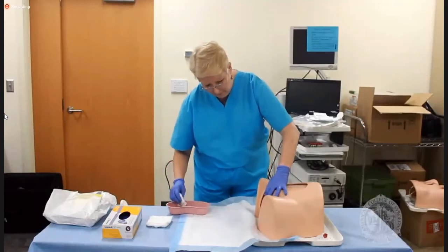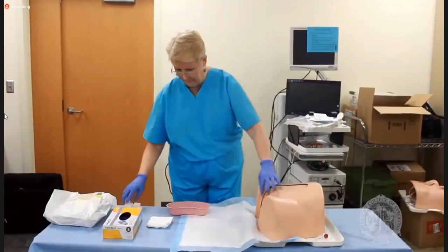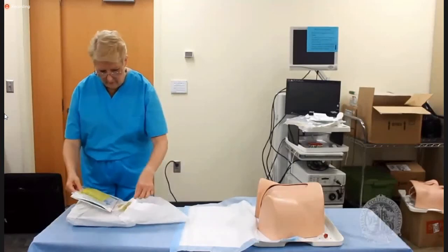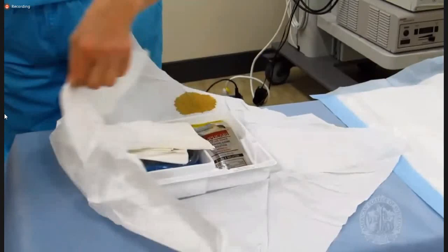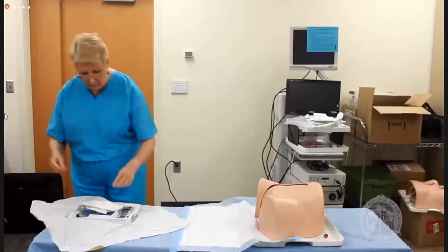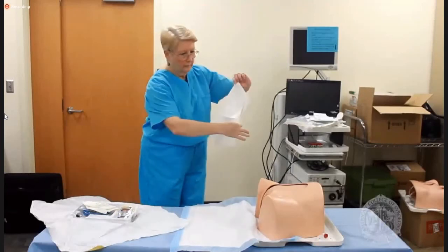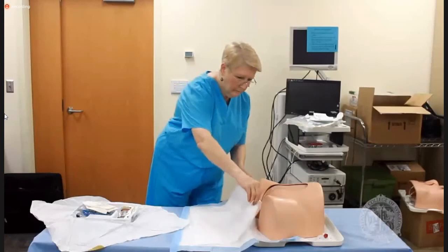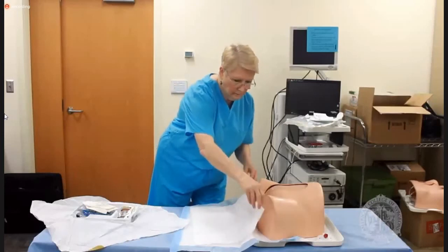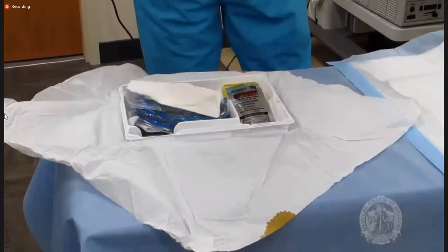Sanitize your hands and put on non-sterile gloves. Cleanse the vulva and perineum with towelettes or with soap and water. Now that the perineum is washed, it's time to move to the sterile portion of the procedure. Make sure to place the sterile field in an easy-to-reach location that ergonomically works for you. You will be doing most of the work with your dominant hand, so that should be the side closer to the field. Place the sterile sheet under the patient, touching as little of the sterile part as possible.